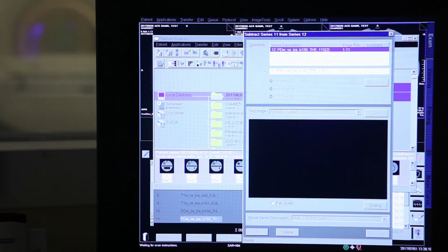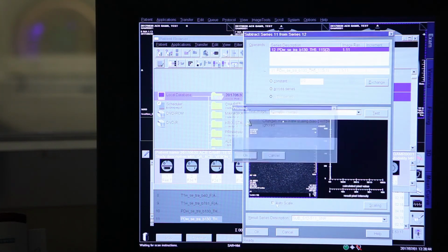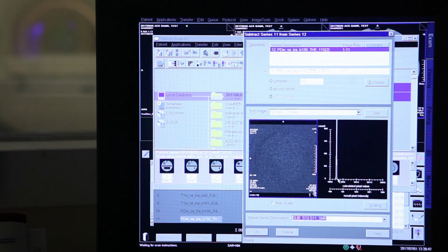If I take auto-scale off, you see I'm shifting near zero. All the magnets in the world do not display negative values. That's the important thing. If they do not display negative values, then if you do the measurements, you exclude zeros. You have only positive values. So actually you have only half of your noise here. That's why you do the auto scale. We shift the difference image, we shift the scale to a positive value, that's what it does.